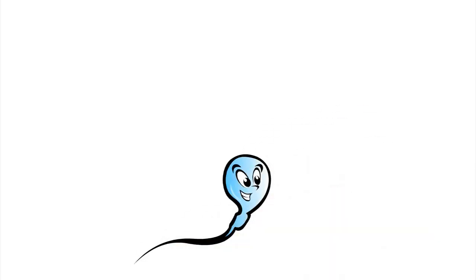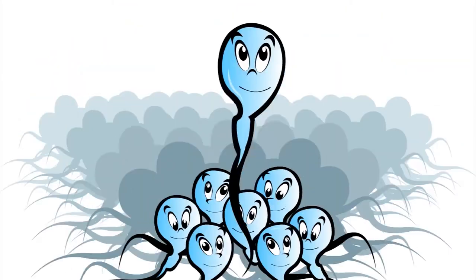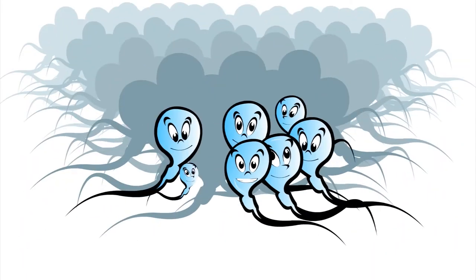A 75-second testing cycle delivers sperm concentration, motility, morphology, functional sperm, and more.